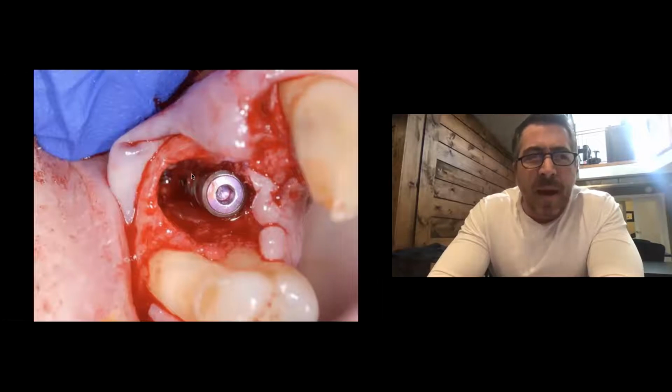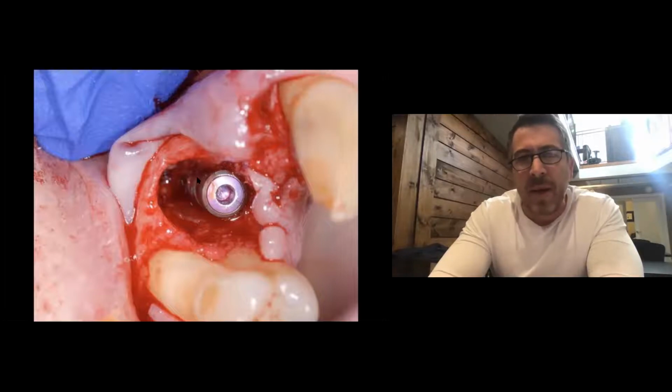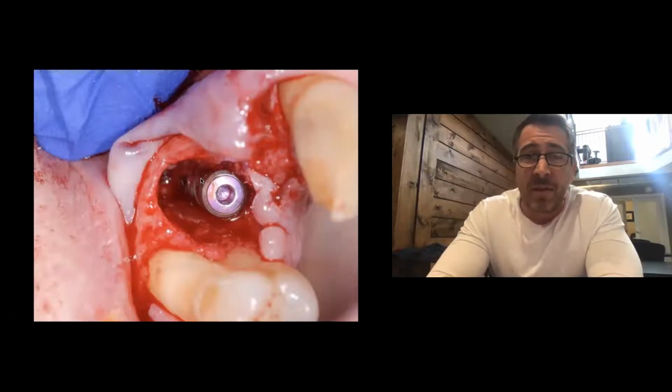If you can imagine, there was a time in life where we used to think that we'd have to fill that whole socket with implant, and we'd have a tapered implant and we would obliterate that socket with implant. But now we appreciate the fact that if we let that all fill in with bone, that bone is going to mechanically handle the load of that implant over time to give us good stability.